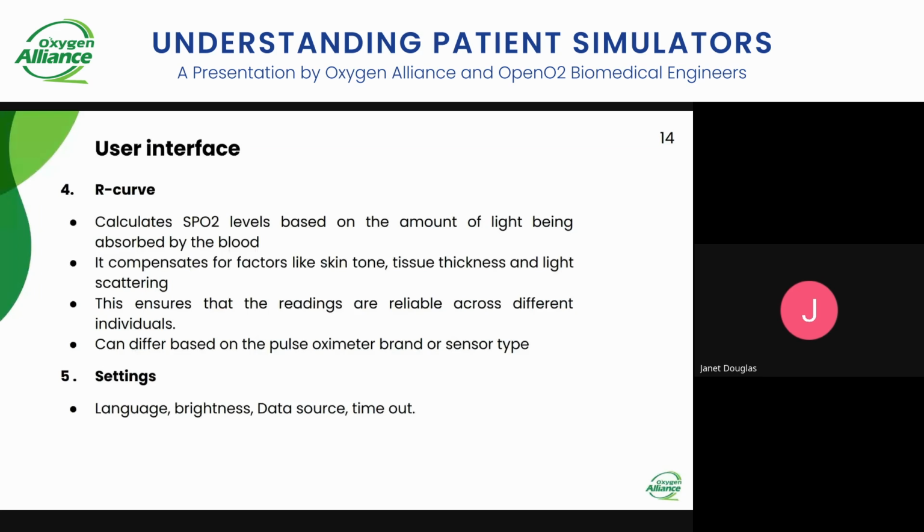On the leak test, you can try to either increase or decrease the value settings. You can try to highlight what you want. And when you click enter, it's supposed to show you the non-invasive blood pressure leak test or the results that appear on the screen. I don't know if that is making any sense. But also, to make sure that you get the recommended information, you can use the manual itself, because in the manual for the brand that you're using, they actually explain everything on how to go about the leak and the source test. Yeah, I think that's what I can say for now.